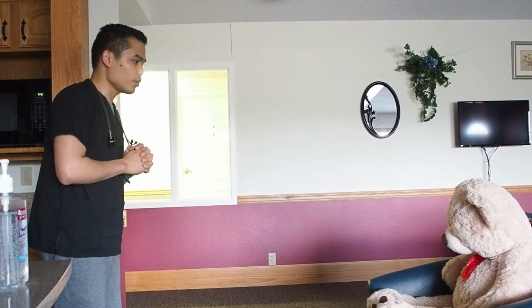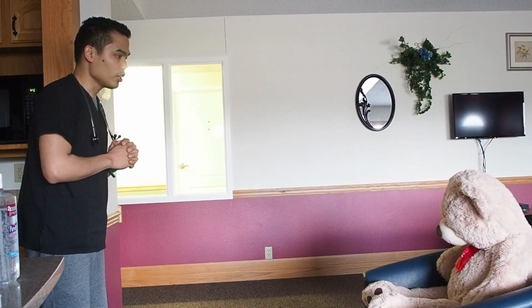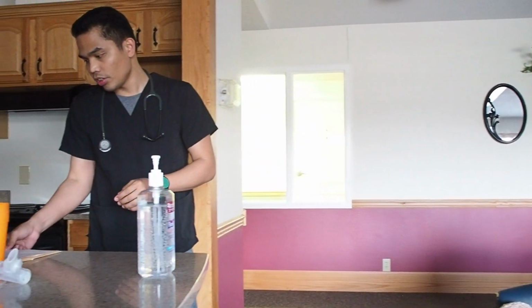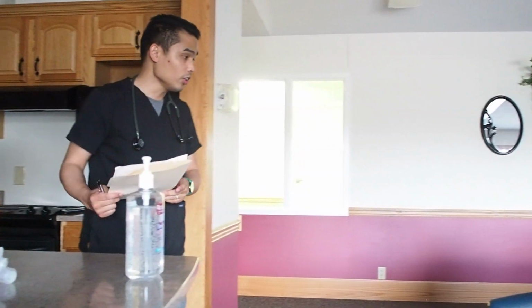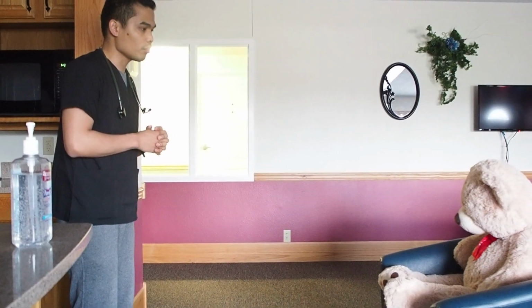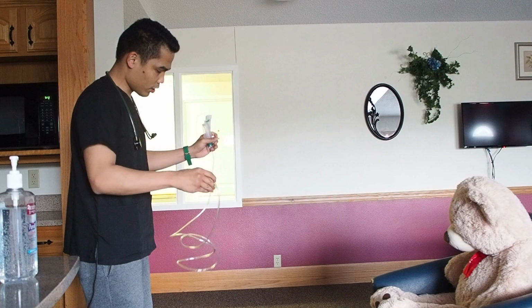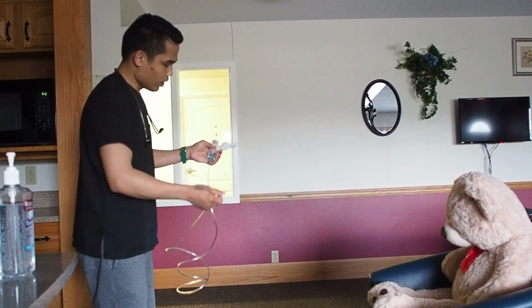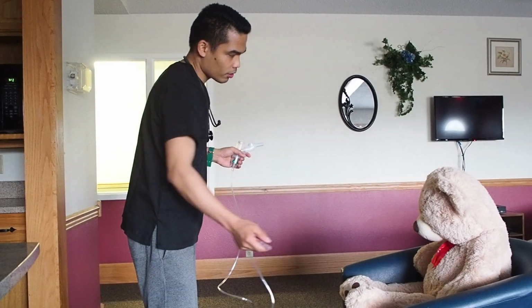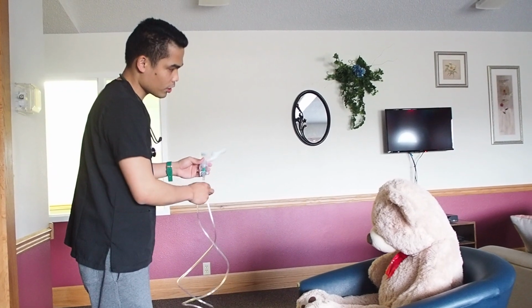So the reason why I'm here is because the doctor ordered a breathing treatment. There will be 3 different breathing treatments that I'm going to administer. The first breathing treatment the doctor ordered was albuterol. It has a frequency of every 4 hours, and it will be given through a small volume nebulization. So this here is my equipment and also the nebulizer. I'm going to use a compressor-based nebulizer. Inside is the medication, which is the albuterol.